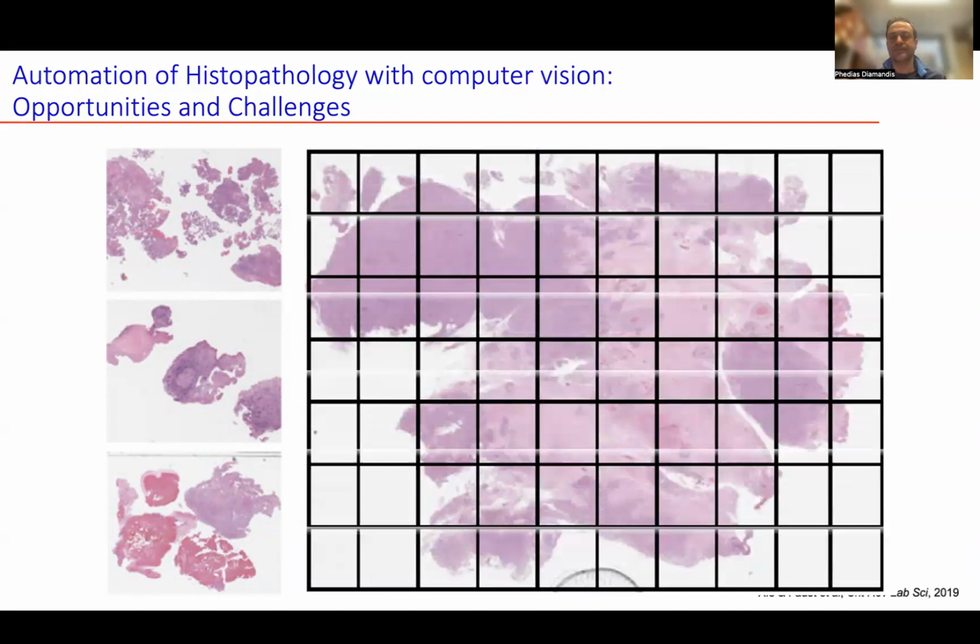in different cancer specimens. And the way to effectively do this is to, because most slide labels are at the slide level, many approaches will do what's called tiling. They'll break the slide into smaller images, and then they will provide annotations for different regions of a slide. And you can see why this is important. Even at low power, you can see that the level of pink and purple in this H&E slide is highly variable. So not all the regions will be diagnostic, not all the regions will have the tumor. And so these patch level annotations are very powerful in teaching the computer to recognize different patterns, and also help improve the specificity of what patterns may be associated with what disease.